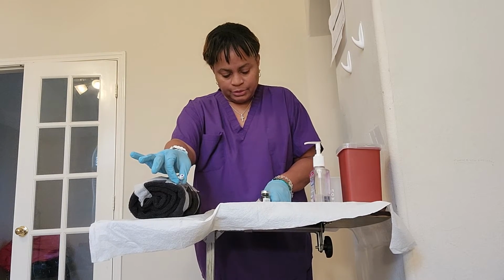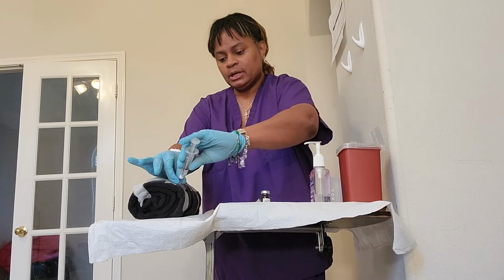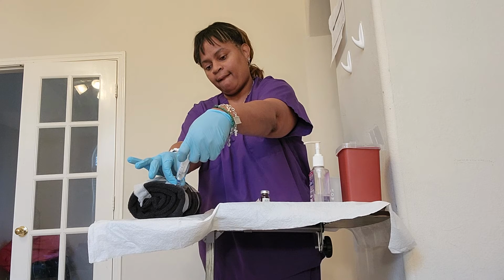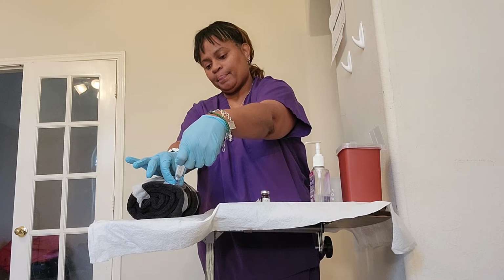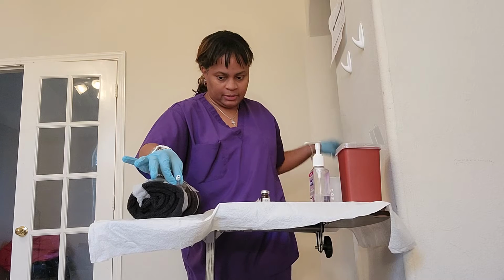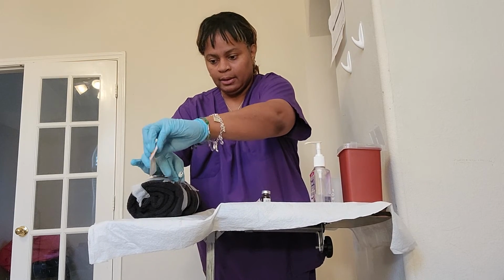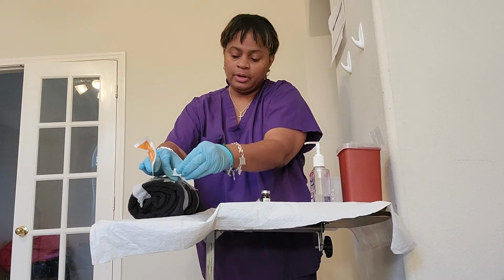And then the next thing I'm going to do is I'm going to take this flush, being careful not to touch the tip. I'm going to insert it into the hub. And this is the 3 mLs of the sodium chloride, okay? We're going to do that slowly. Good. We can just get rid of this over here in this trash receptacle because it is not a sharp and we're allowed to do that, okay? Then I'm going to get another alcohol pad. And I'm going to clean your hub one more time.